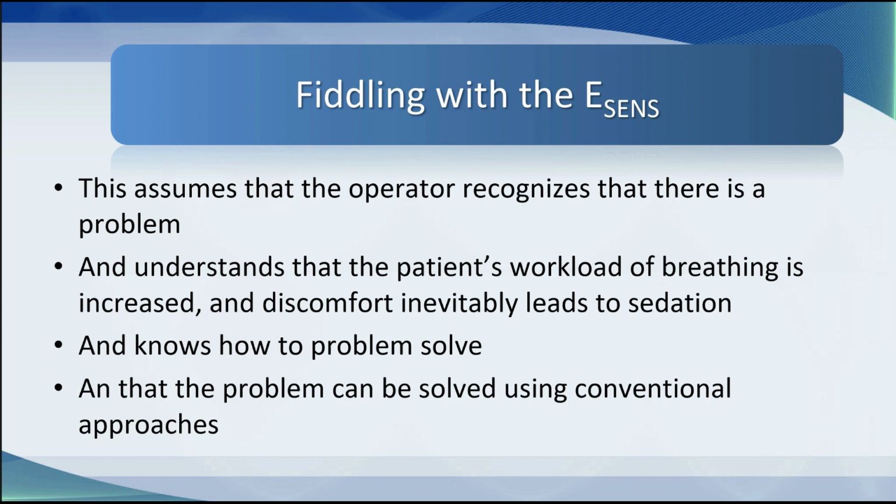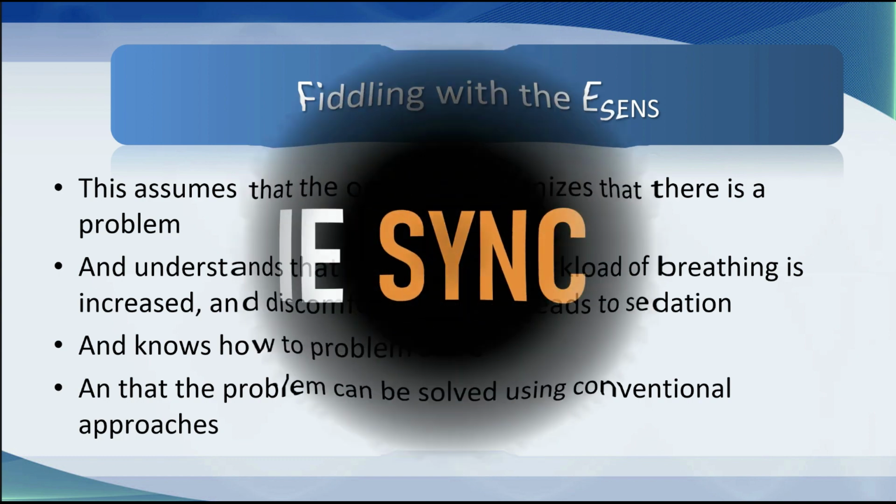Within these ventilators, there is a whole pile of technology that is looking at flow going in, flow going out. There are flow sensors, pressure sensors, resistance sensors. And as a consequence of this, the industry has moved on and said, yeah, we can solve this problem. This is a different way of doing it.